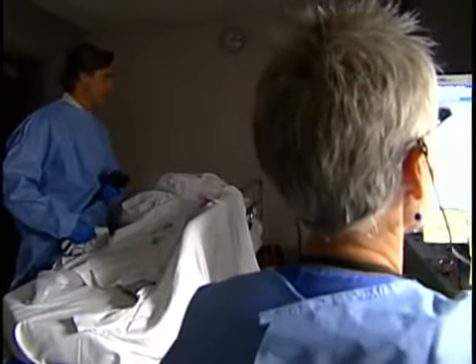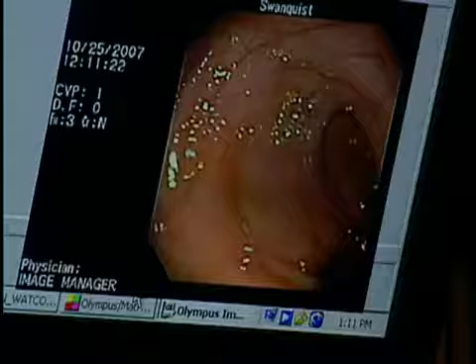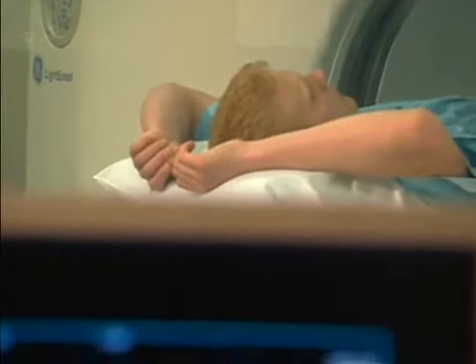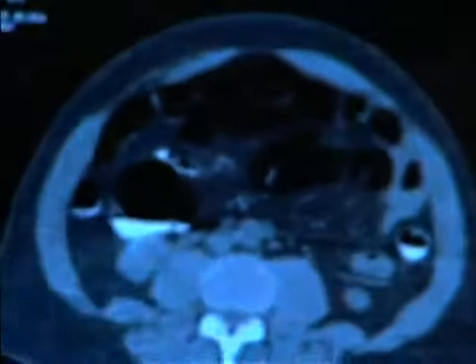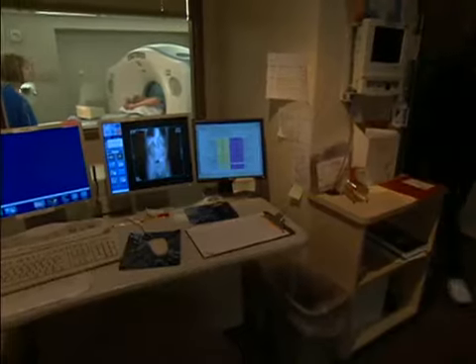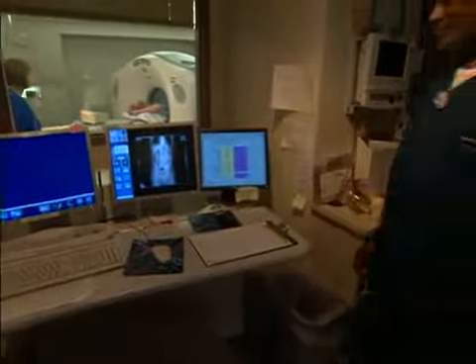Unlike traditional colonoscopy, which involves inserting a scope into your colon while you're under sedation, CT colonography is quick and non-invasive. You can get your exam in the morning, go back to work later that morning. Dr. Joel Fletcher says right now the bowel preparation for CT colonography is the same as for colonoscopy. You can only have liquids the day before, and you have to drink from 2 quarts to 1 gallon of this to clear out your system.